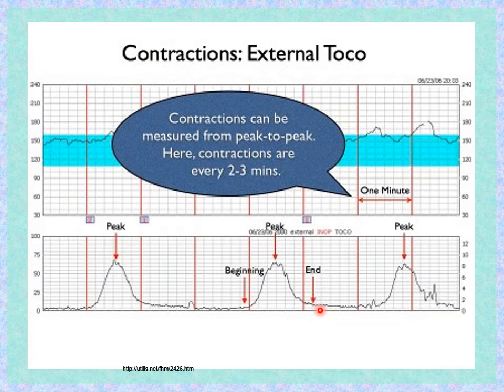Strength of the contractions generally range from peaking at 40 to 70 millimeters of mercury in the first stage of labor to over 80 millimeters of mercury in the second stage of labor. In order to accurately measure the intensity of uterine contraction, an internal uterine pressure catheter should be in place. The water must be broken for insertion. If the water is not broken, the intensity of uterine contractions must be palpated.